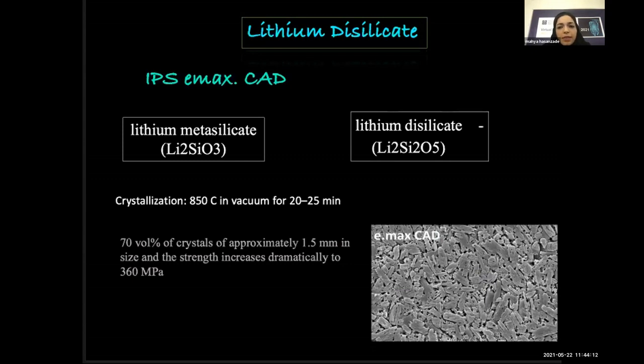Machining of fully sintered ceramics typically creates significant tool wear and residual surface flaws that could in the long term be detrimental for the in vivo performance of the ceramic. A solution was pre-crystallized or partially crystallized ceramics, which was introduced with the lithium disilicate system. The blue ceramic contains a metasilicate and lithium disilicate nucleus and exhibited a flexural strength of 130 megapascal.